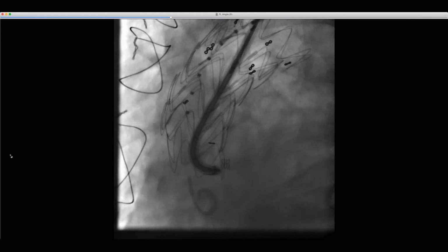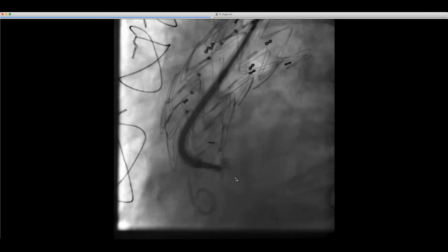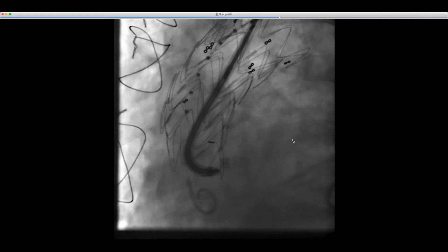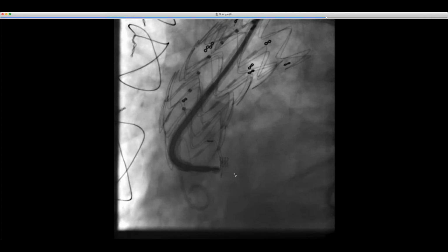So, there are a couple of studies apparently on this technique, and have you all seen them showing that it does help to decrease the incidence of endo leaks after deployment? Have you all seen these yet, these endo anchors? Nope, not yet.